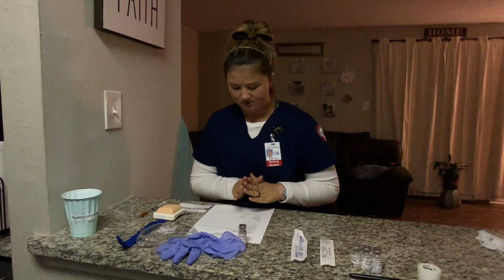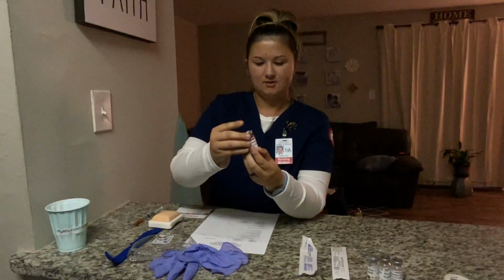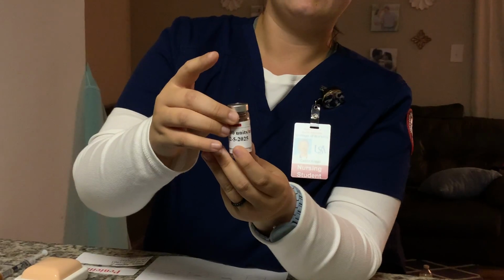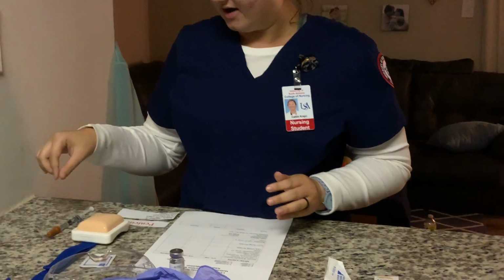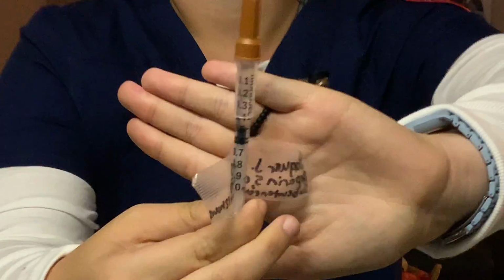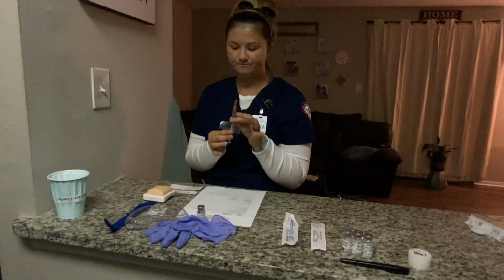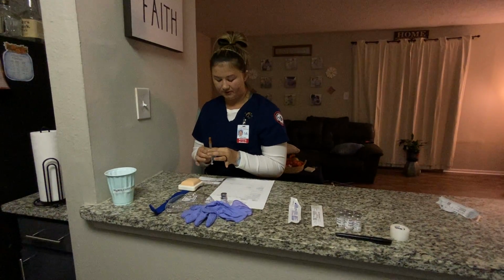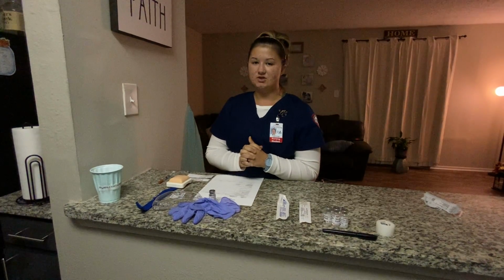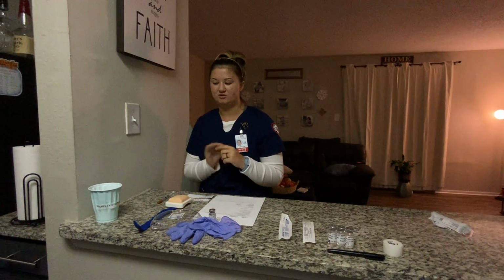So I did the right patient, so now I'm going to do heparin, in which I have heparin. And the dose is 5,000 units, in which this is 10,000 units per milliliter, which means I need 0.5 milliliters, which is what I have, 0.5 milliliters. And I'm going to be giving it subcutaneously, which is a TB syringe and needle. And I'm giving it every 12 hours, in which it has been 12 hours. And I would note that the indication is that it is an anticoagulant medication, and I would document anything needed to be documented up until this point.